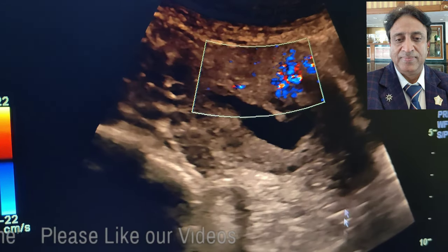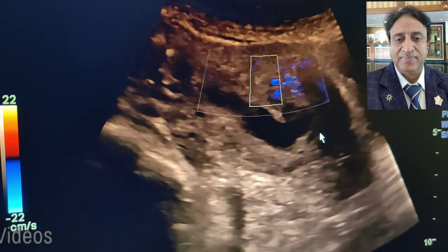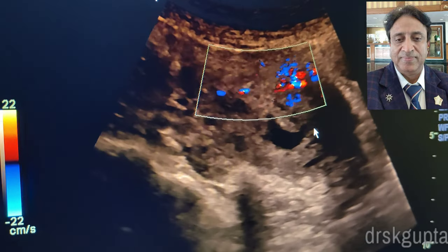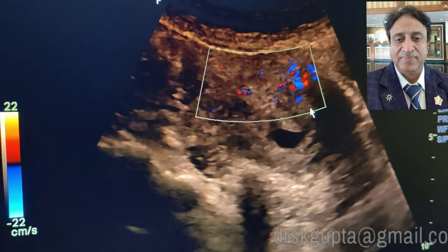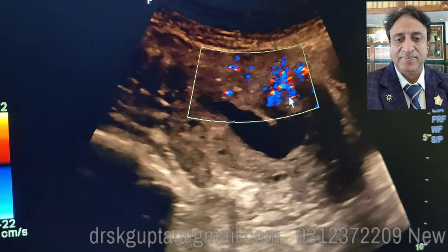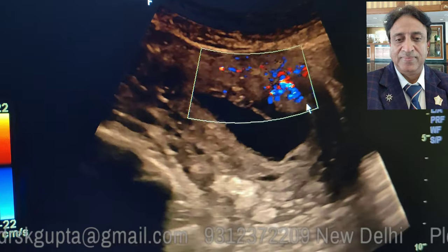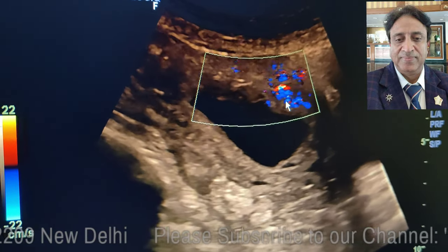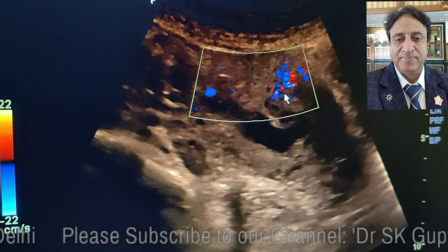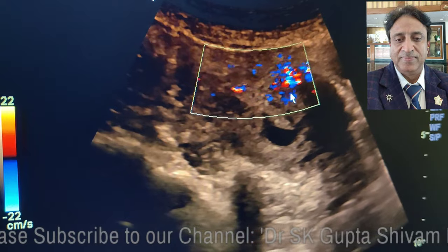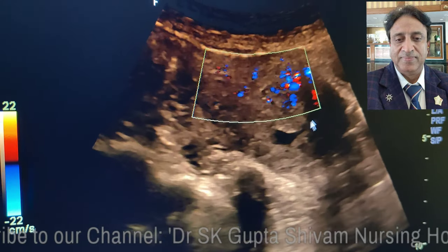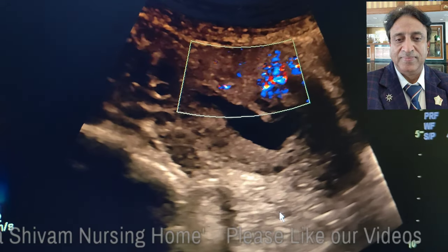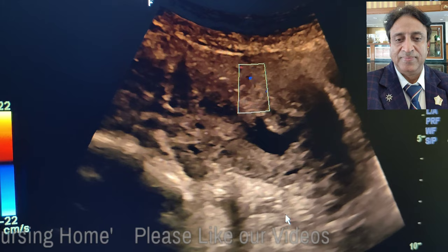Sometimes one might be confused with the color uptake around the sac. Here you can see that there is some color uptake, but this is nothing but the uterine blood flow behind the placenta. There is no flow in the placenta itself or in the fetus, so do not be confused.